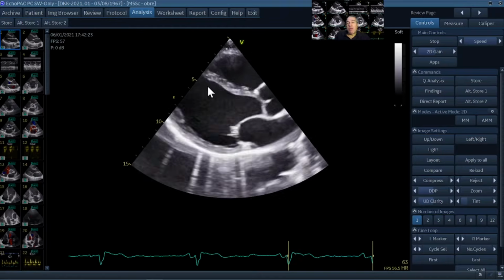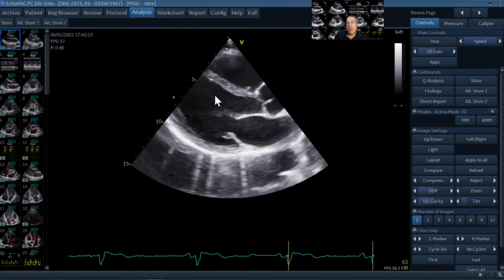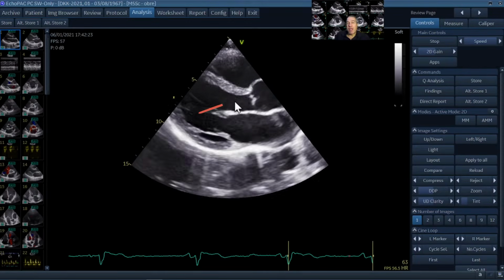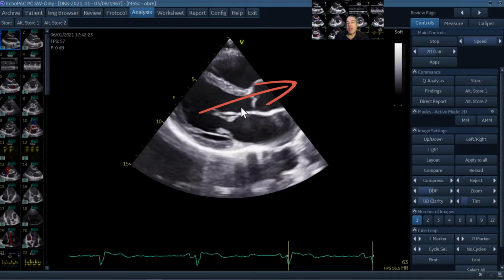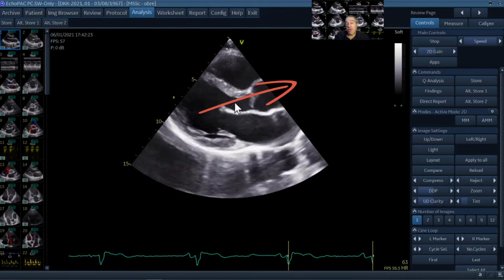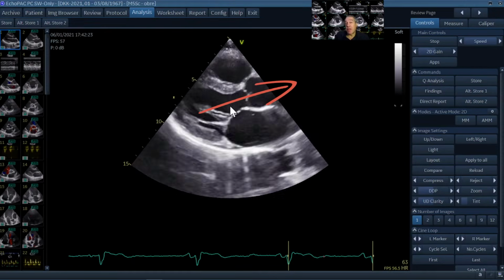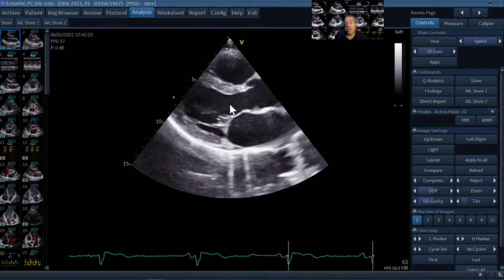If there would be one papillary muscle up here in the anterior wall, then the mitral leaflet might be dragged more to the outflow tract and might cause obstruction of the outflow tract, which we now only see in a specific pathology, the hypertrophic obstructive cardiomyopathy.